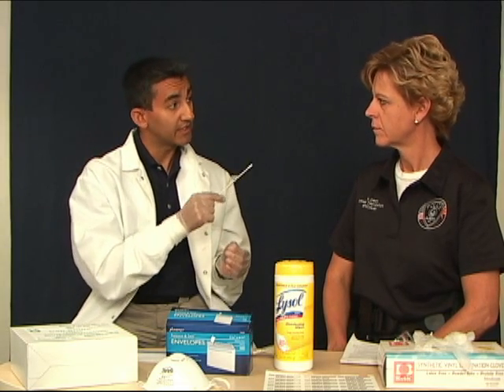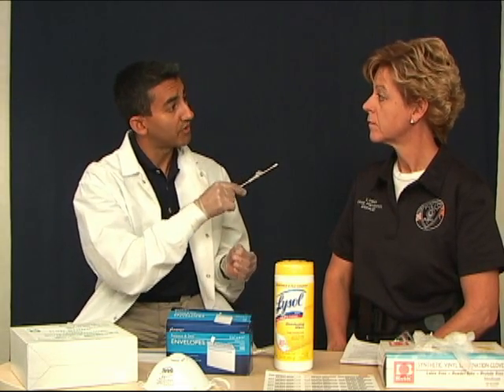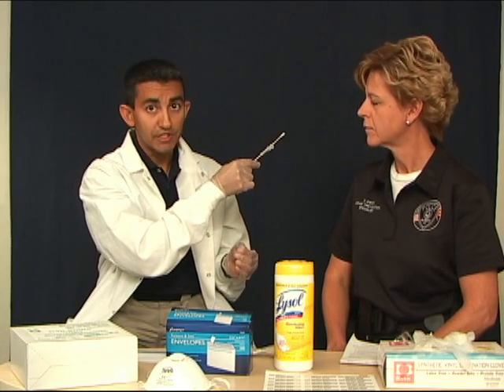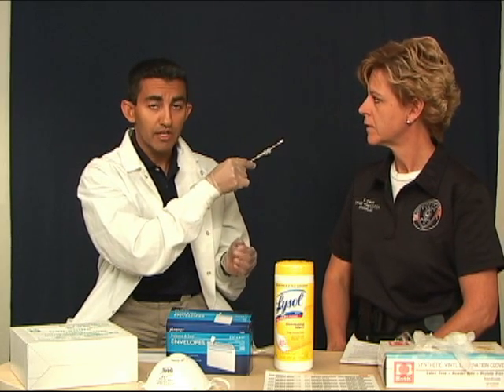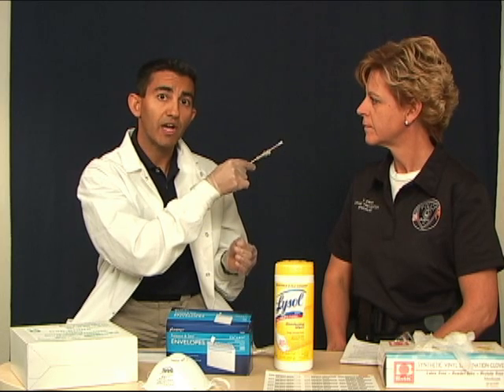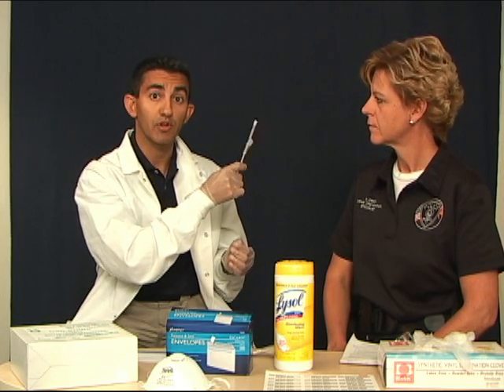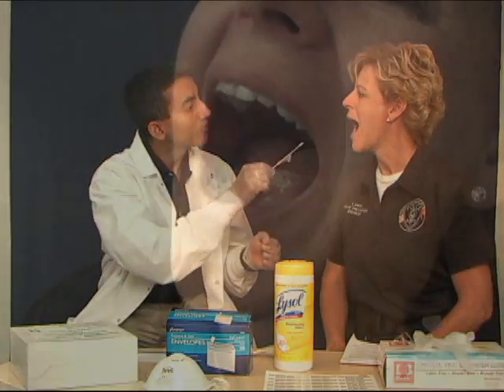Now when it comes to swabbing inside the cheek, we're going to swab inside the cheek, and we're also going to go to the fold of the cheek line and swab there. Swabbing for about 15 seconds or 5 strokes. I think 5 strokes is what we're going to go with. That is good enough to get you a good sample on your swab. Okay? Go and open your mouth.